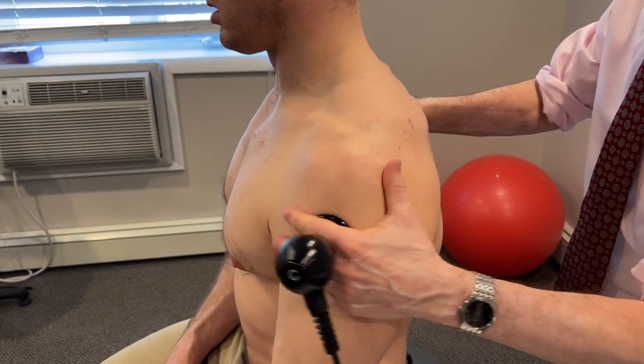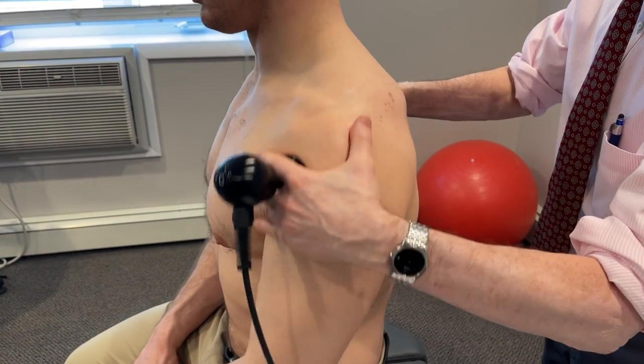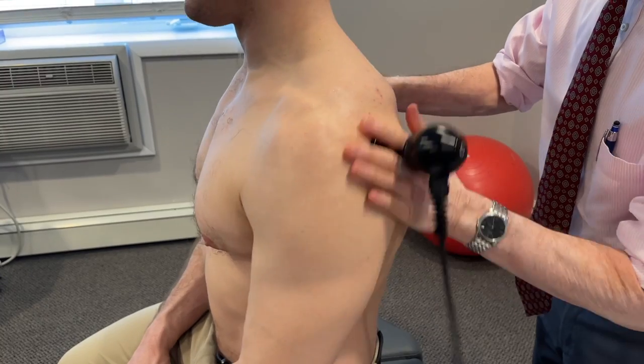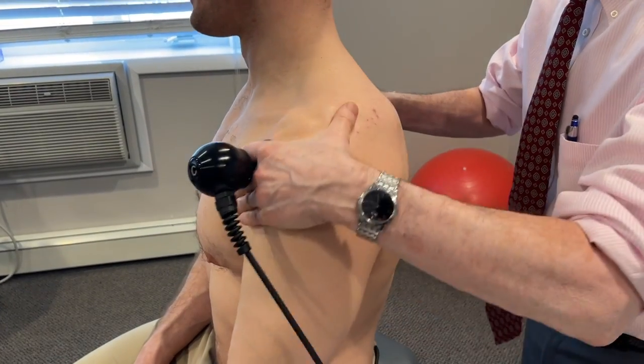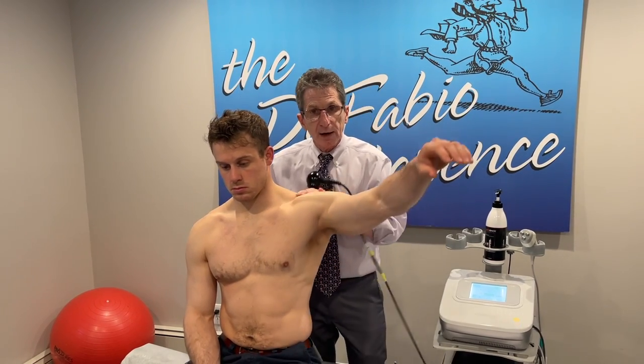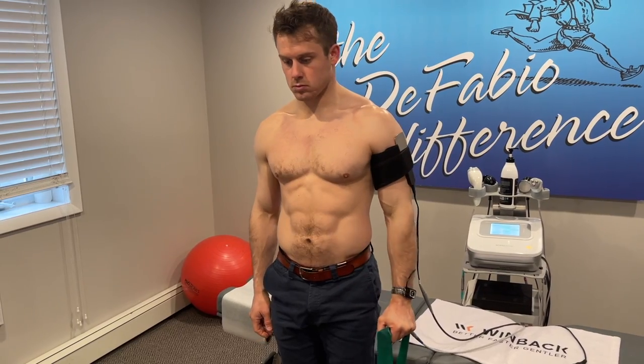It can start by creating some heat into the tissues. That's the capacitive mode. It's superficial — gets into the muscles, gets into stimulating lymphatic circulation, and I can feel it getting hot already. I can do heat therapy with motion; we can do it with exercise.